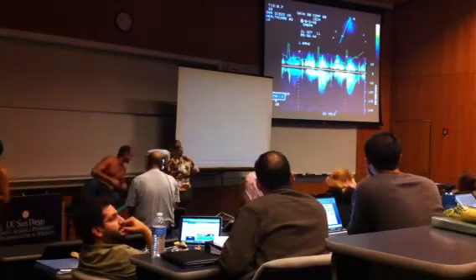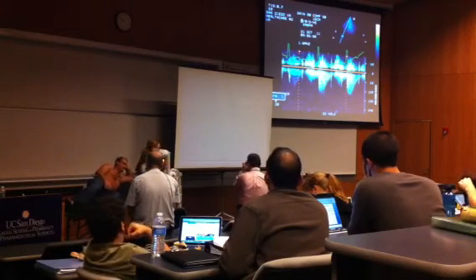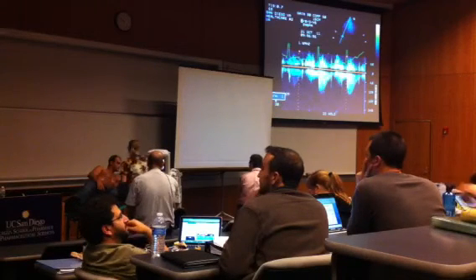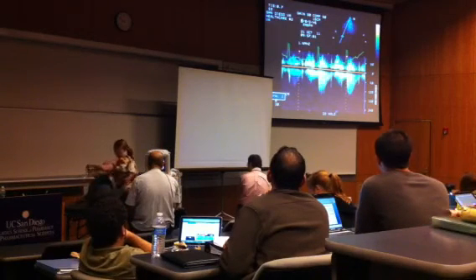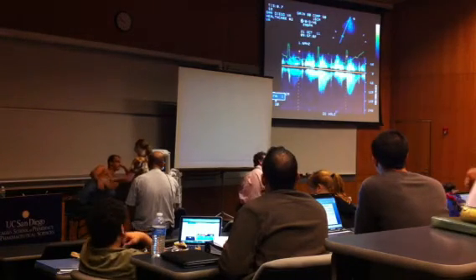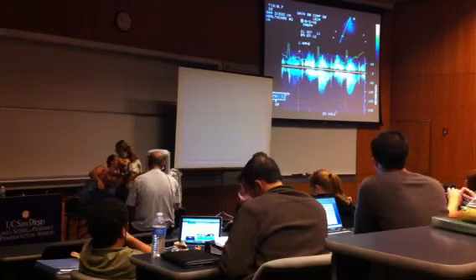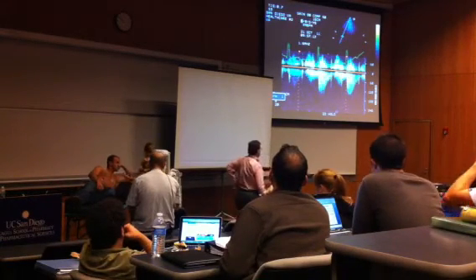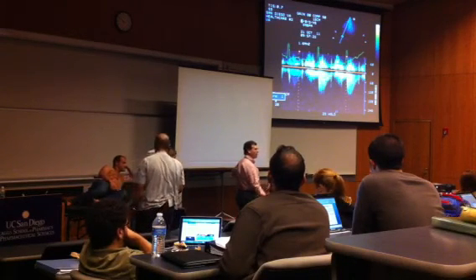All right, so we're going to wind up here, and what I'd like to do, Kelly, is let's get a 4-chamber view, and we'll trace some volume. So what I'm going to try and show you in the next couple of minutes is, we've seen the pictures we can take, we've seen some of the timing events we can get, we've seen the anatomy we can get, and what I'd like to do now is, based upon that view of the left ventricle we've seen already, see if we can measure ventricular volumes and calculate a stroke volume.